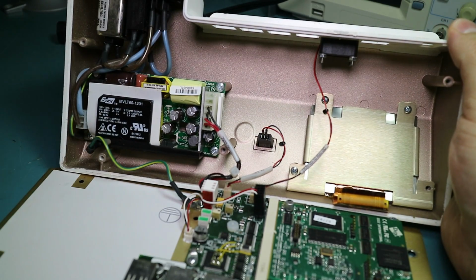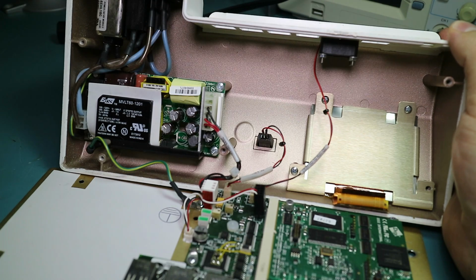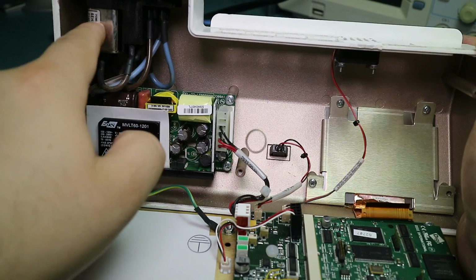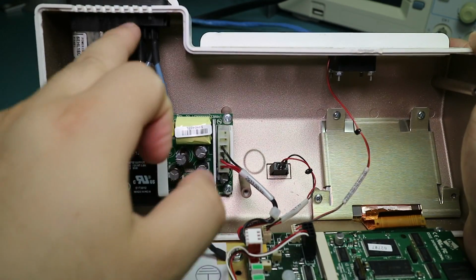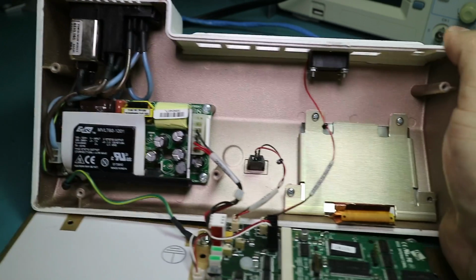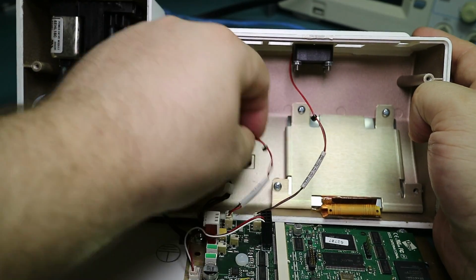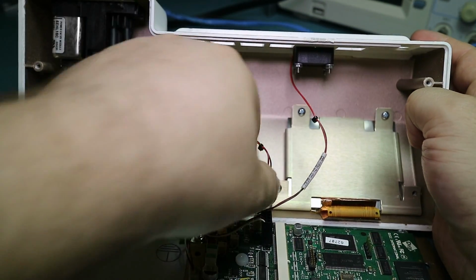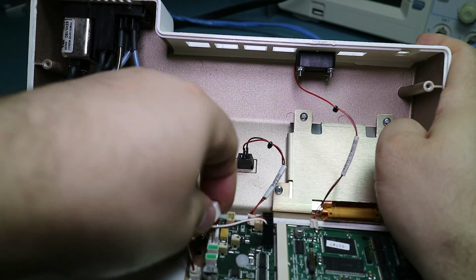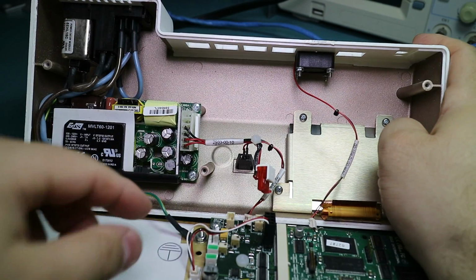I might actually keep this because this is a 12 volt at 5 amp power supply, and it's made by EOS, and it looks very nice. There's a big filter unit here, and there's a fuse module. It's a nice compact little power supply. And we got the fan, and this goes off to the LED. So let's just unhook that, unhook the fan, unhook the power supply, which comes along on just this little custom cable. It's just being fed 12 volts.